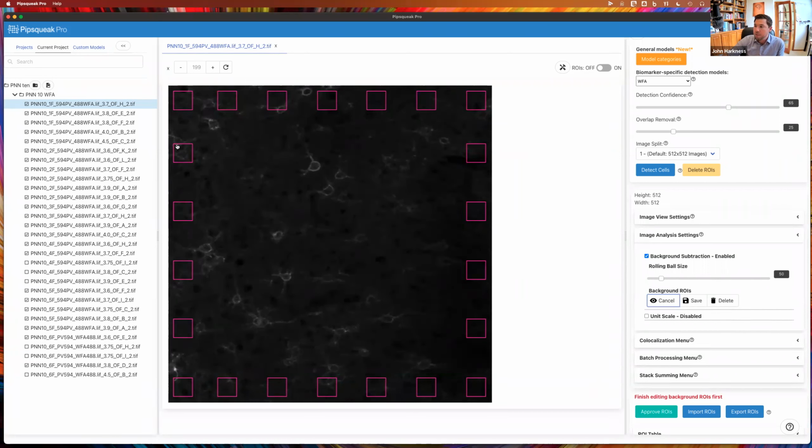So here's an example of that, where this box is right on top of a cell. So obviously that's not background. But we're looking at the whole curve of these intensities, and we're actually taking the middle third of that curve, assuming that some of the bright cells need to be removed, and actually some of the dark cells need to be removed. If I have rips in my tissue, or if some of these boxes fall outside of my staining, we actually want to make sure that we're excluding those.